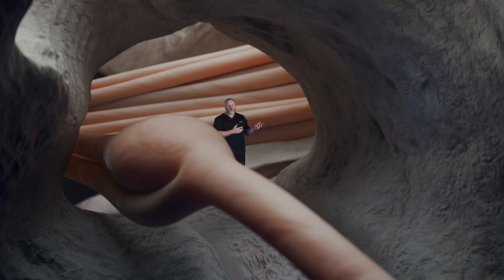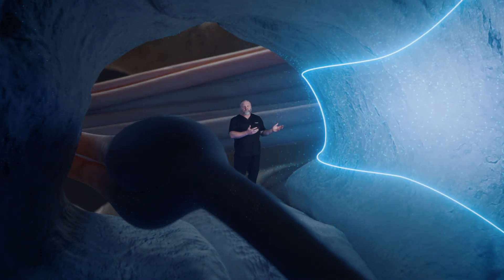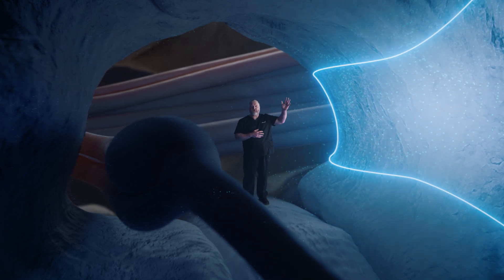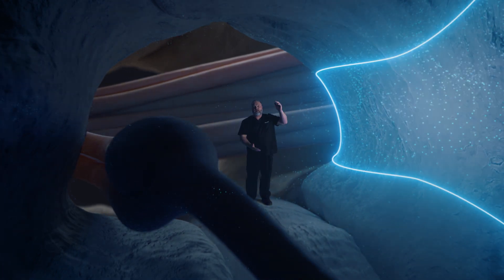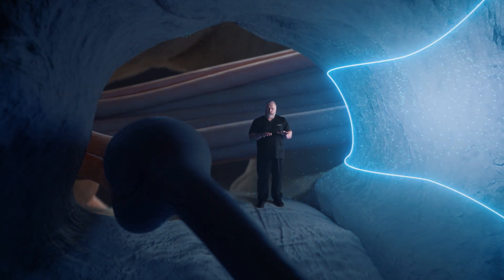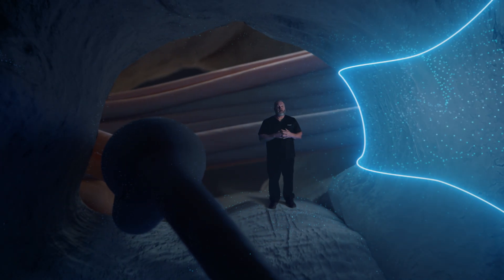Once you find the pedicle, you know where everything else is. The pedicle is the lighthouse of the spine. From here, the arch, superarticular process, and disc are easily recognizable. This is your home. If you're ever feeling lost, just return to home. As a quick tip, if you did your approach without making a large fascial defect, the soft tissue and bony foramen will hold the scope docked in the foramen in the home location.